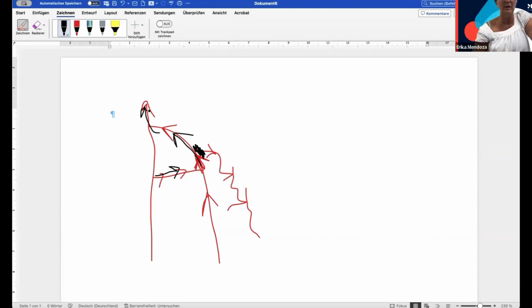but it will be anterograde, draining again to the deep vein, because obviously this great saphenous vein has such competent valves that the reflux from the deep vein was not able to revert the flow here. Normally we expect that we would have a reflux here, but this didn't happen in the leg. So he has a very healthy great saphenous vein overloaded by a perforating vein, giving this overflow to a proximal tributary and then being healthy again. This is a very interesting situation for me. This is why I wanted to share it.